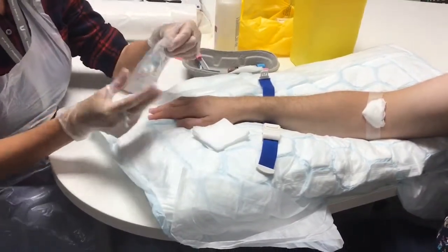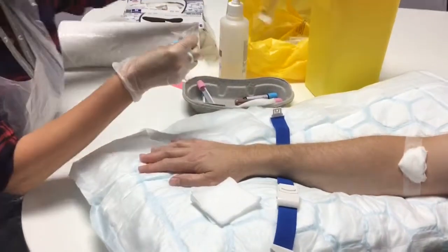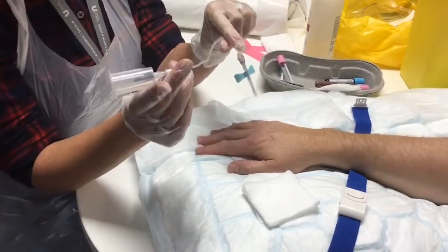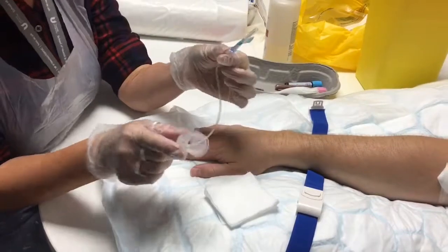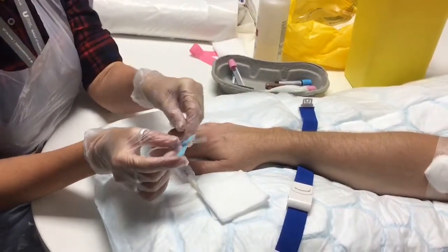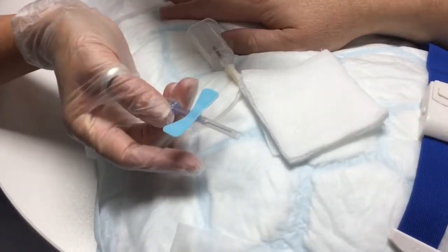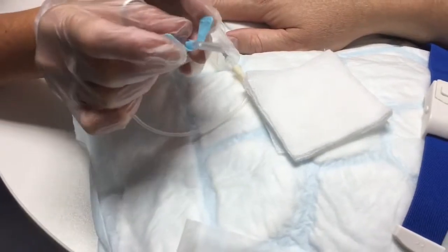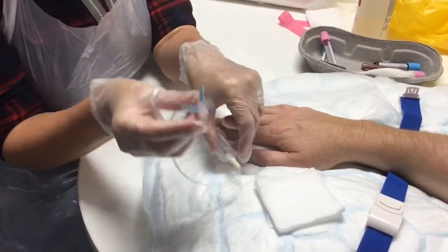We've checked it's all in date and intact. You can see you've got your vacutainer at the end with your grey bit for the blood bottles, a long piece of tubing, and the little butterfly needle at the end. Your wings have to be up — you can see the patterned part is the inferior part and where the holes are is the superior part. I tend to hold it like that to manipulate and move it.